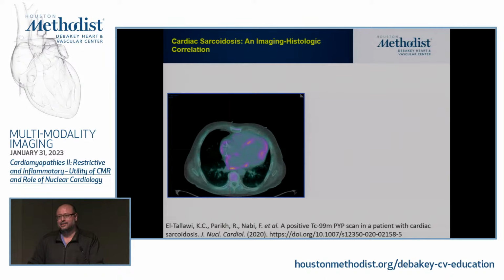The question is, do we need a biopsy to make a diagnosis? I think inflammation in general can be from multiple conditions. You need some sort of way to make a diagnosis of what the pathology is. It could be SLE. So all the inflammatory cardiomyopathies that Dr. Shah just talked about can appear similar on FDG PET. That's why you need to know what the primary pathology is here. And sometimes it may require multiple biopsies to do so.